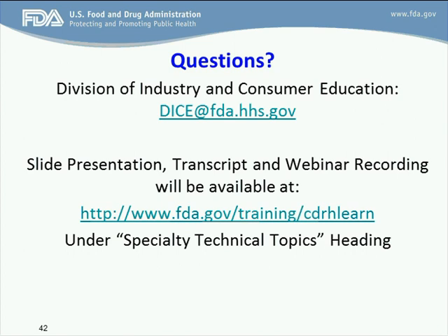Okay, so that would depend on the use of the device, the particular formulation of the artificial test soil that we construct in order to represent the anatomical site where the device is used, and then the prevalent markers from that ATS formulation. So there's several considerations there in the design of your protocol. And in general, we're giving guidance here, but a couple questions have come up regarding sample sizes or number of uses or types of soil used. It's important to think it through as best you can, to find the best way to get the most meaningful data that you can.